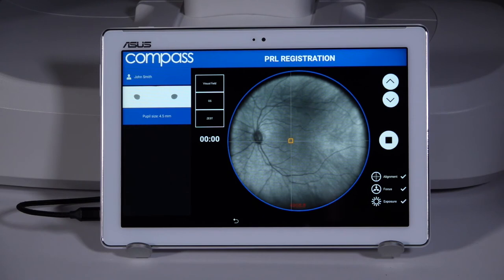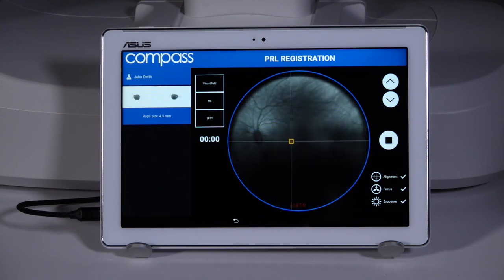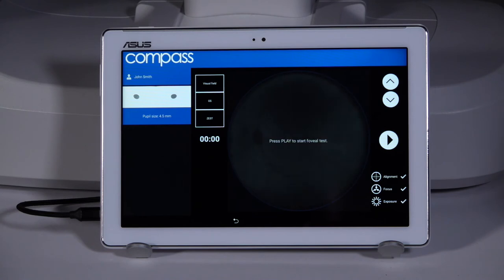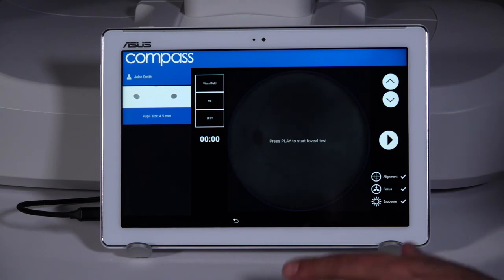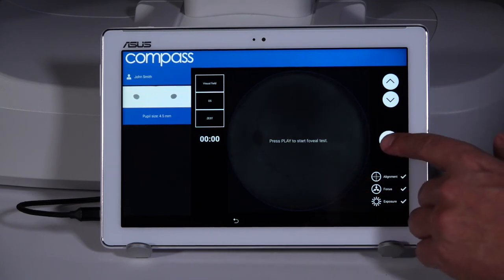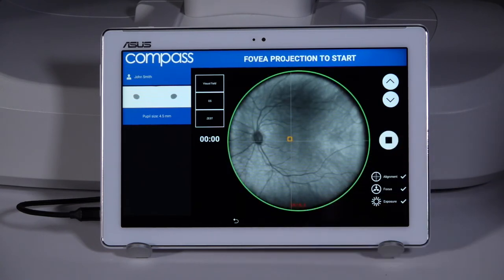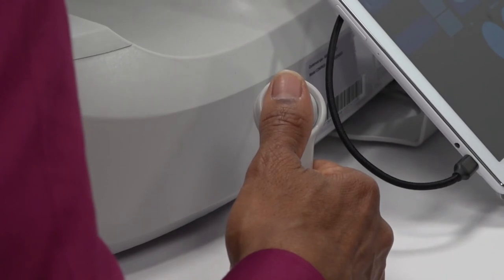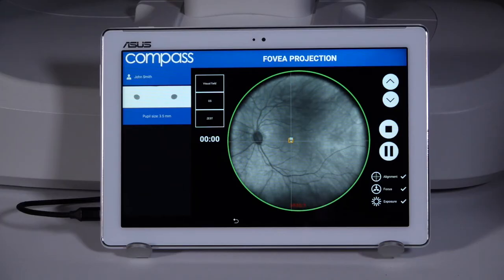Instruct the patient to look steadily at the green fixation target for 10 seconds. Next, the compass will test the patient's foveal response by presenting four fixation targets while thresholding one single point in the center of the targets.